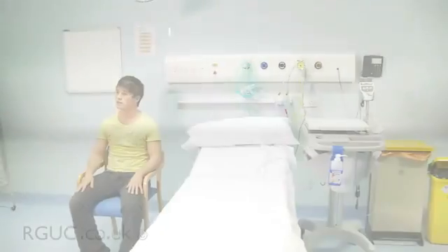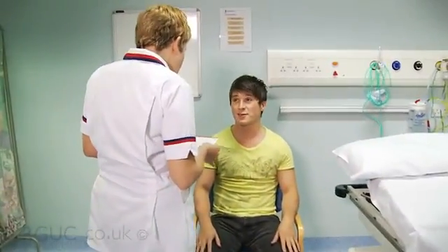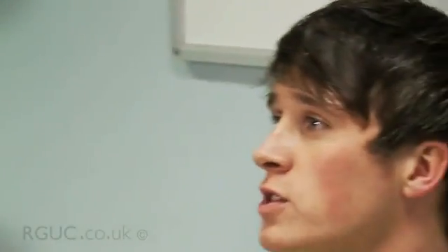It is important to ensure you have identified the correct patient. Confirm the patient's identification verbally by asking them to tell you their name, date of birth, and the first line of their address. If you are performing an inpatient ECG, also check the patient's wristband to verify their patient identification number. Cross-check the patient's details with the request form. Check whether the patient requires a chaperone or interpreter to support them.